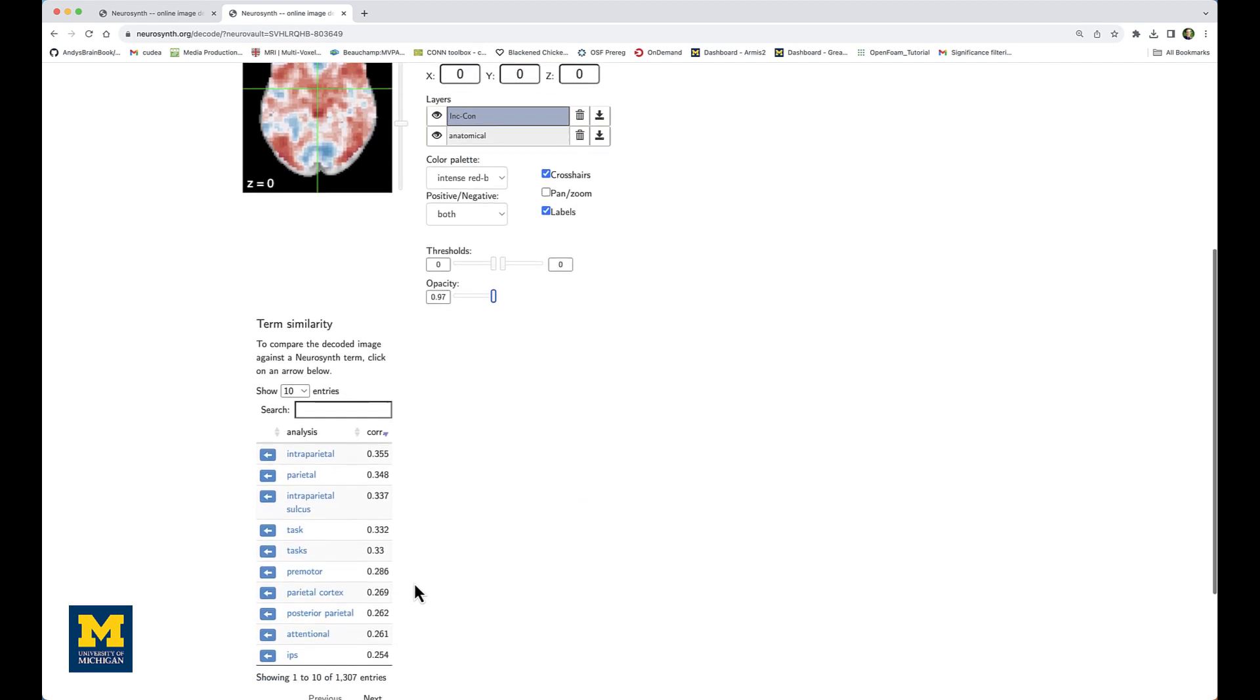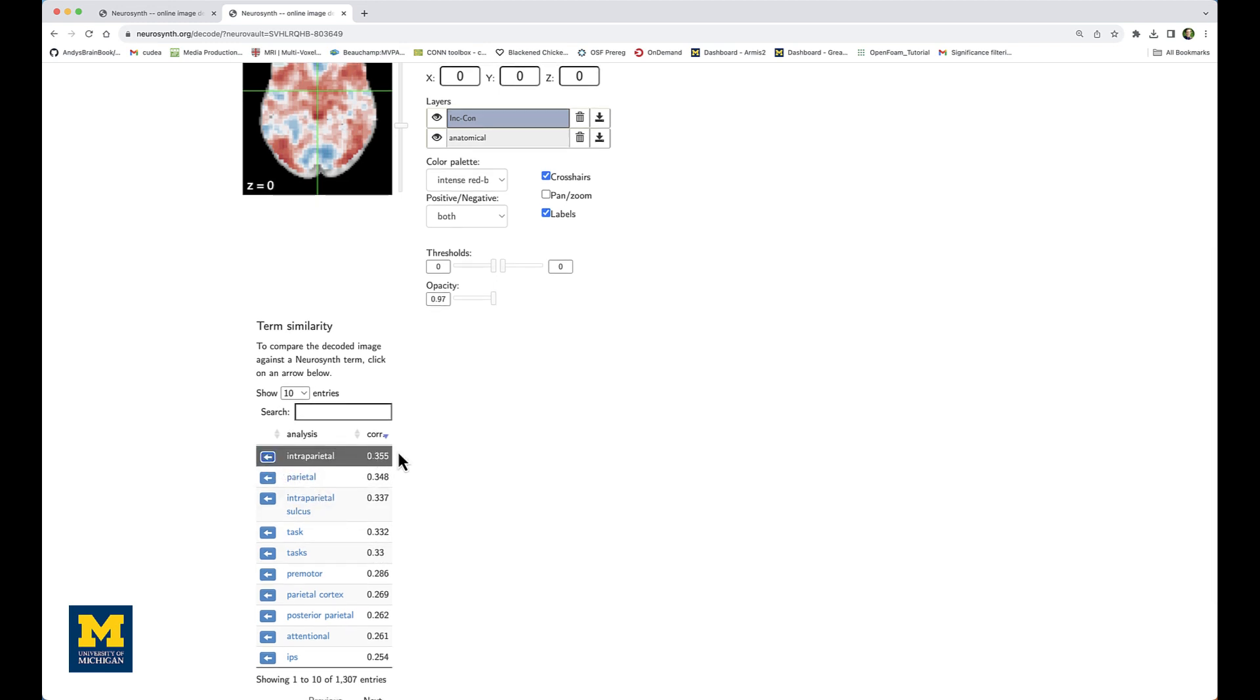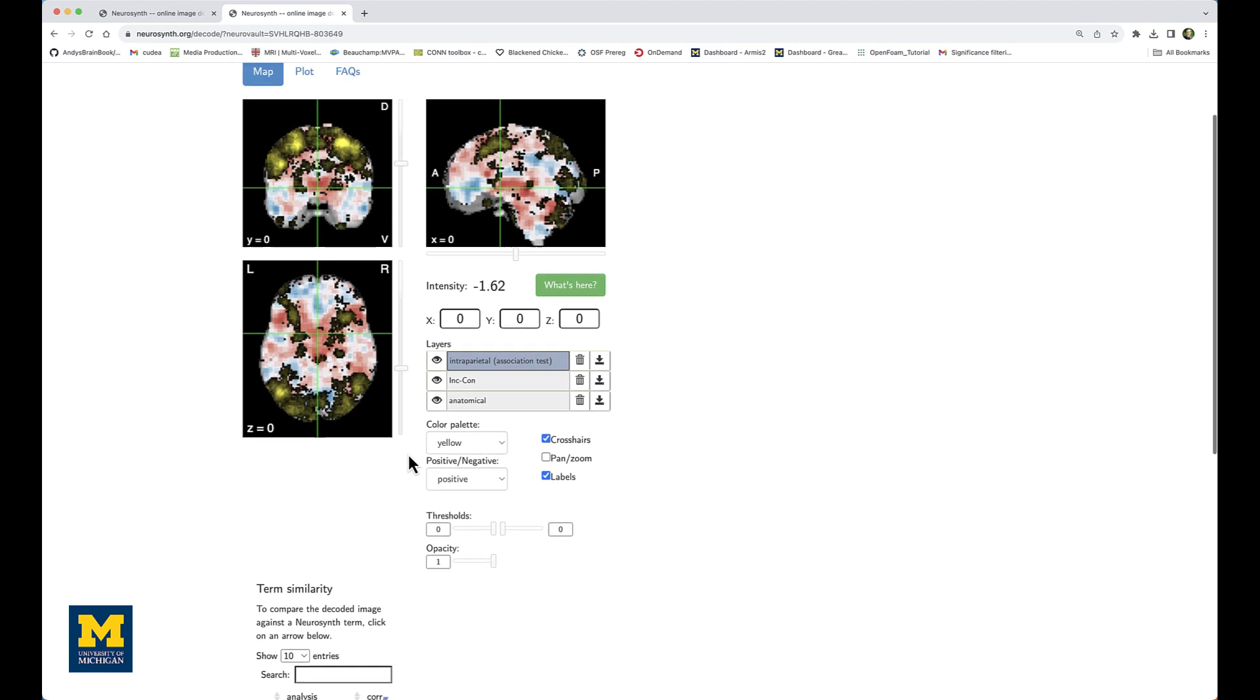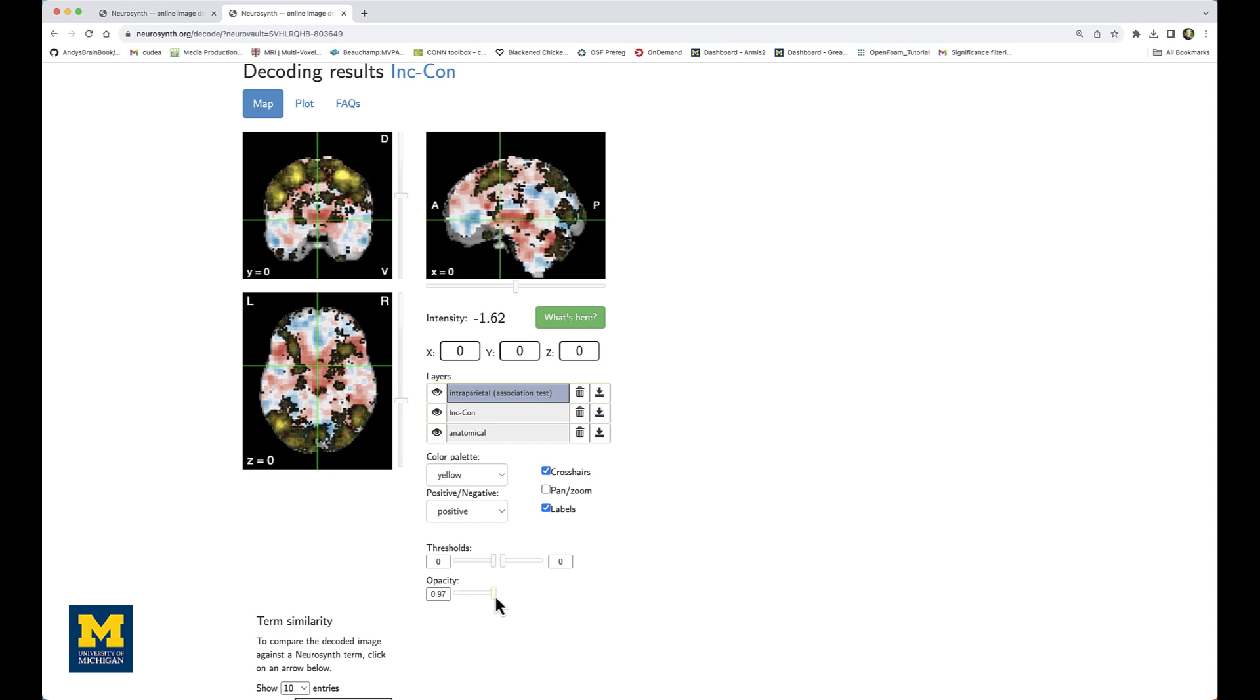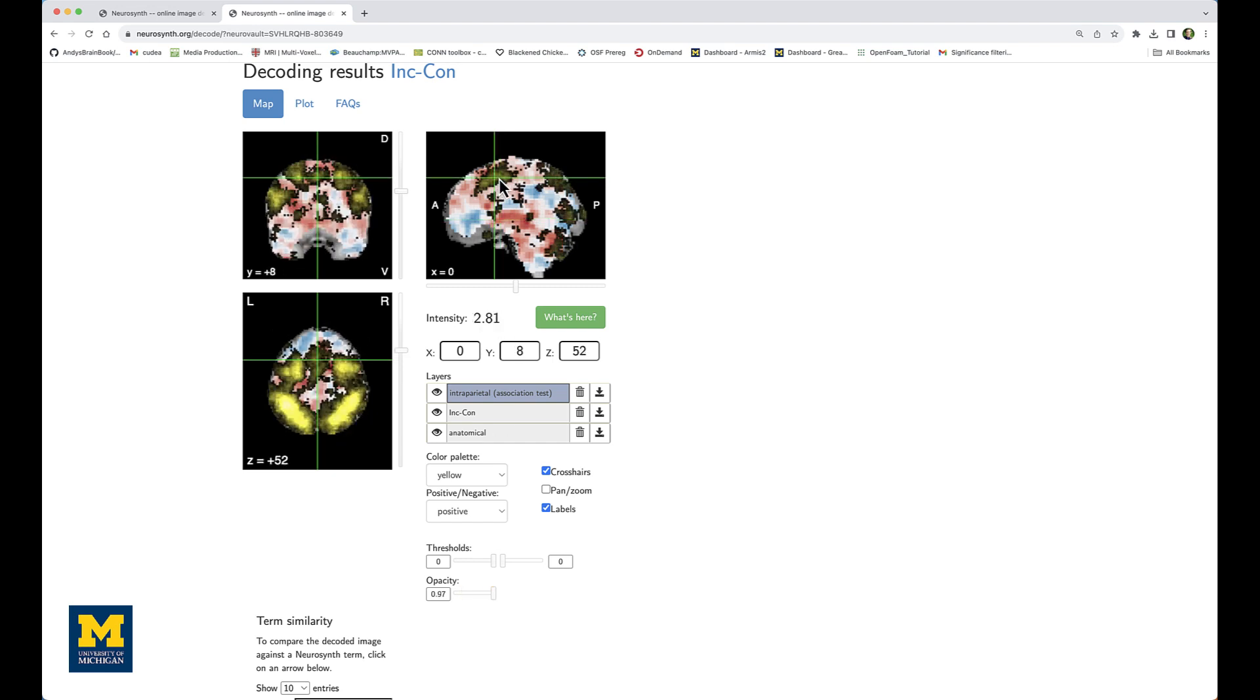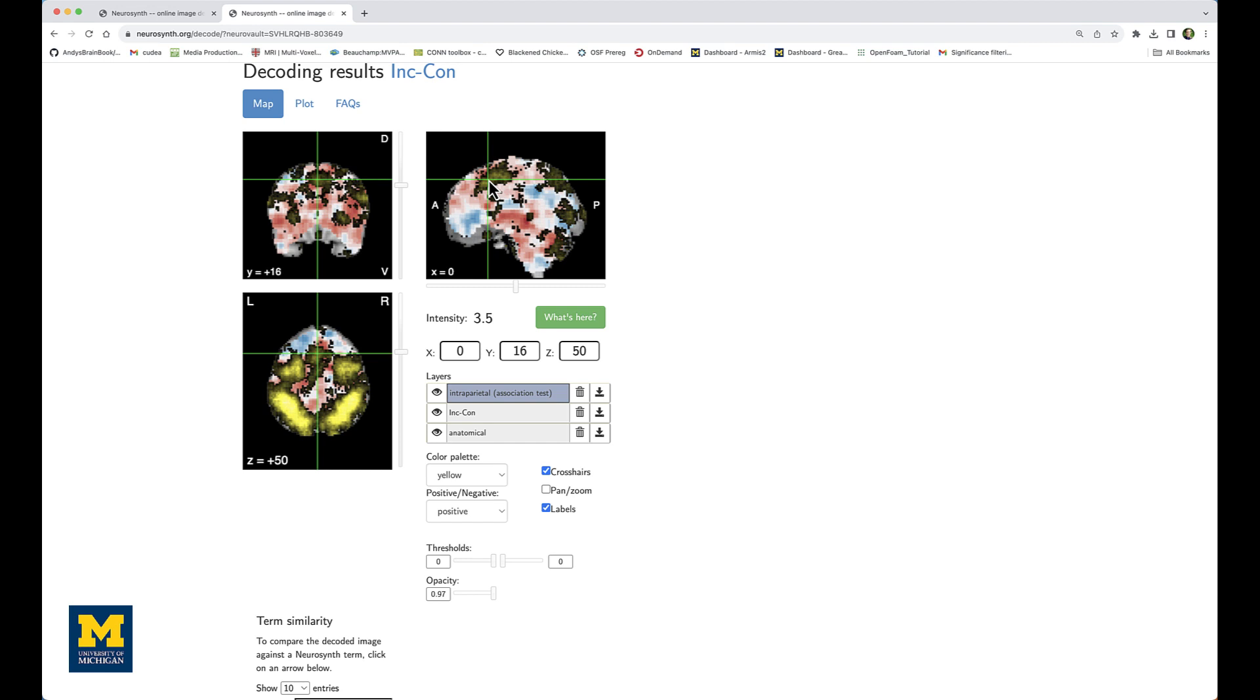And then scroll down to the term similarity region. In this case, the highest correlation map is the meta-analysis term intraparietal. And if I load that, you can see that there is a high degree of correlation, especially in the intraparietal areas, which is probably why that search term has the highest degree of correlation with the map that I uploaded.